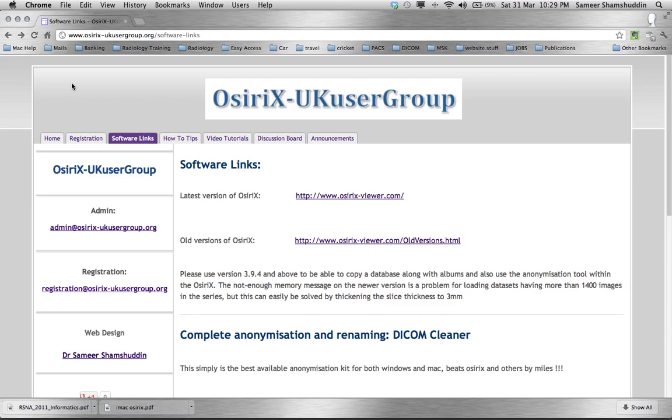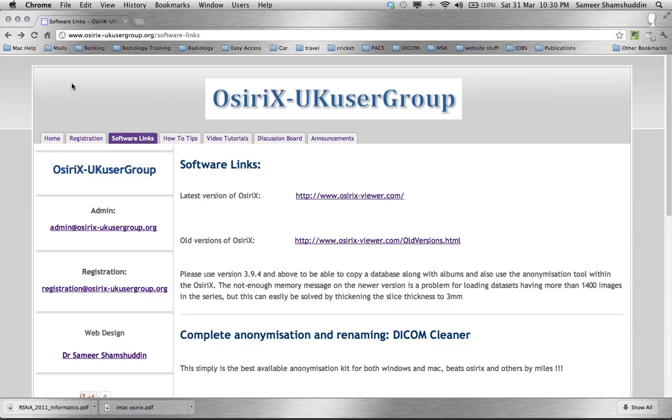Why am I using DICOM Cleaner and not OsiriX? This is because there are many unsafe DICOM tags in a DICOM study and it is very tedious to strip off each one of these within OsiriX. Whereas DICOM Cleaner software gives multiple options to strip them all together and take home a completely cleaned and anonymized version of the case without affecting its original acquisition value.